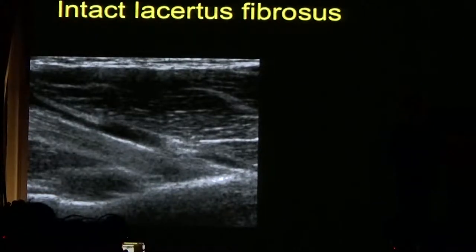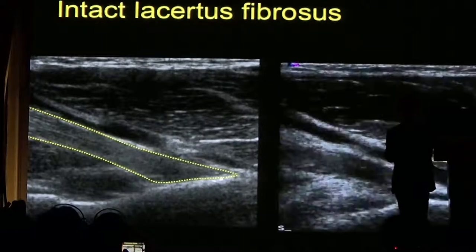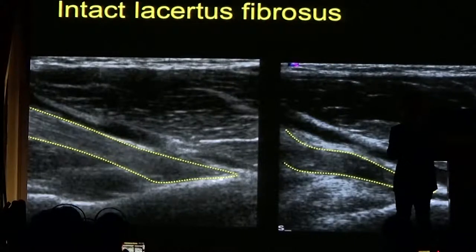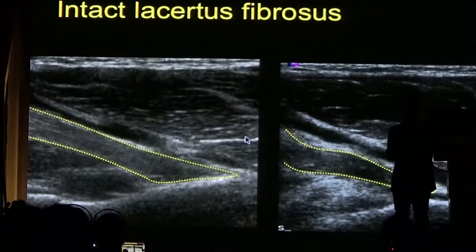This is an example of a patient with an intact lacertus fibrosus — the structure that keeps the tendon in place. Here is a patient with a high-grade partial tear at the insertion — you can see laxity of the tendon with a hypoechoic line because the tendon is disrupted. But because the lacertus fibrosus is intact, there is no retraction of that biceps tendon.